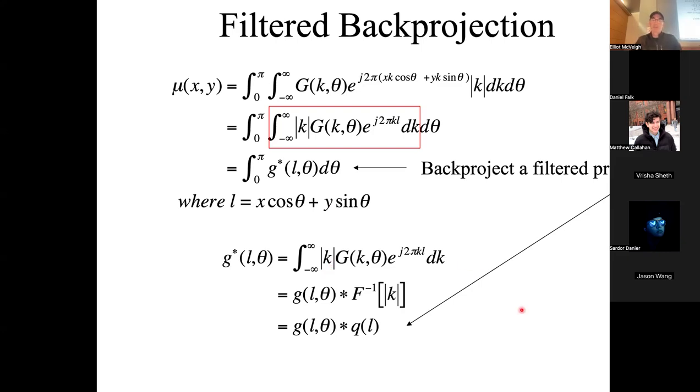And we remember, right, the inverse Fourier transform of a product is what in the other space? It's the convolution, right? By the convolution theorem, if I have a product in one space, I get basically a convolution in the other space. So to see how this thing is related to GL theta, we can look at that.